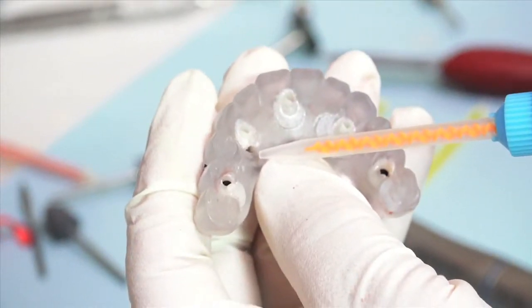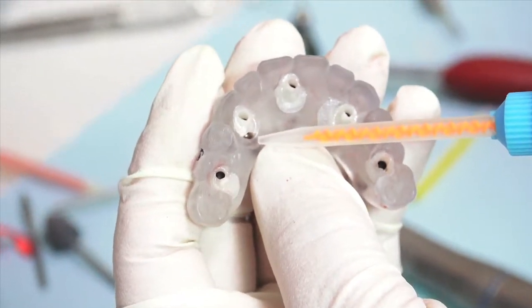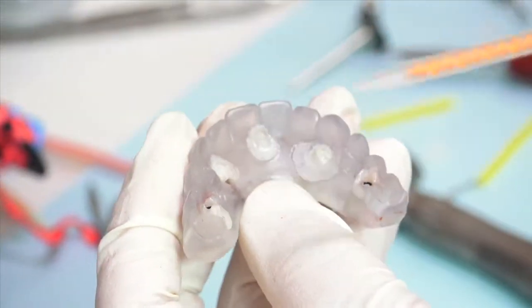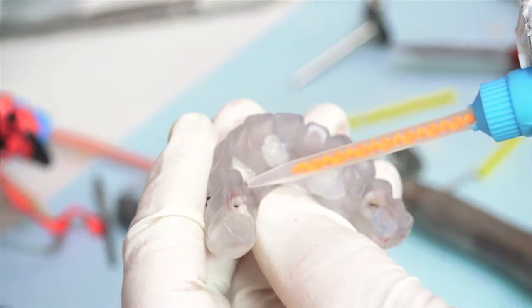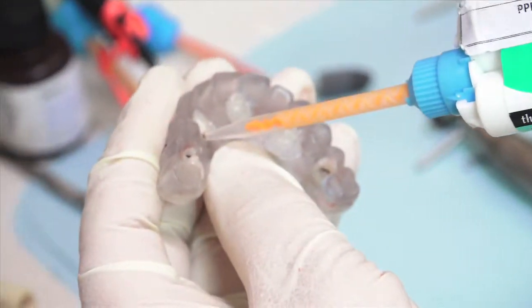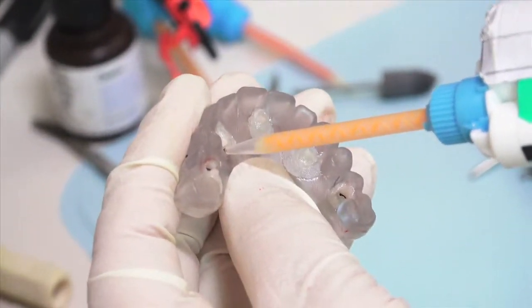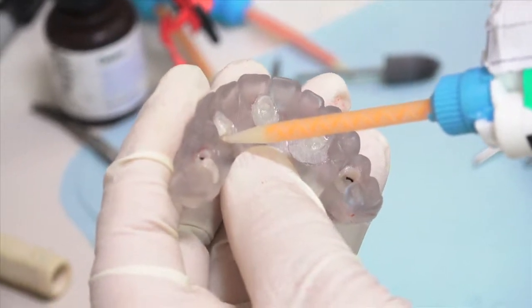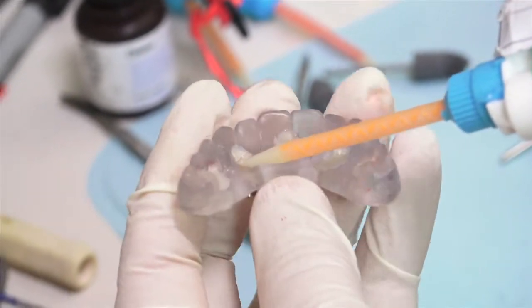The tissue side does not need to be as smooth or have a hygienic transition from the base up to the metal margin of the temporary cylinders because the patient will be wearing this only for a short period of time during the final bite record and the final impression for the definitive prosthesis.